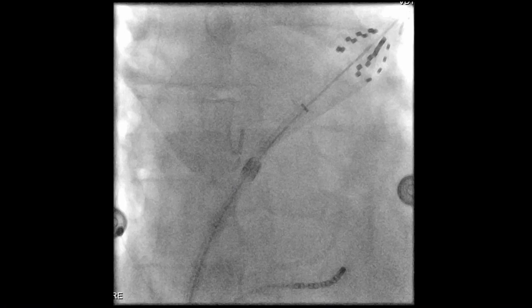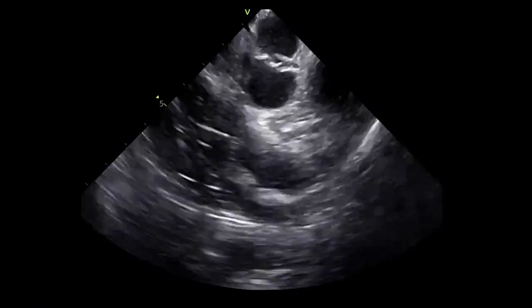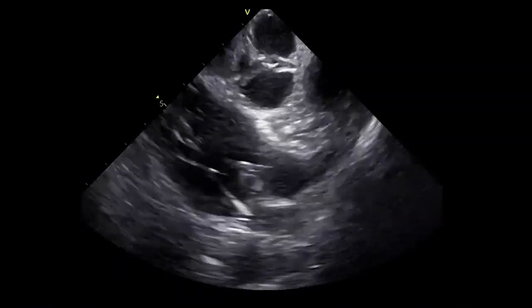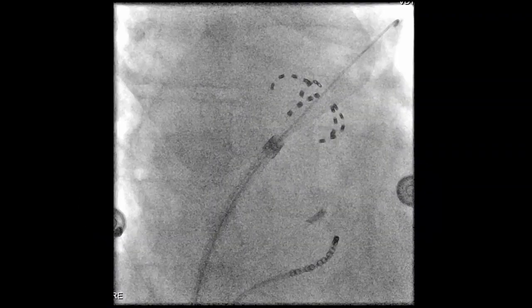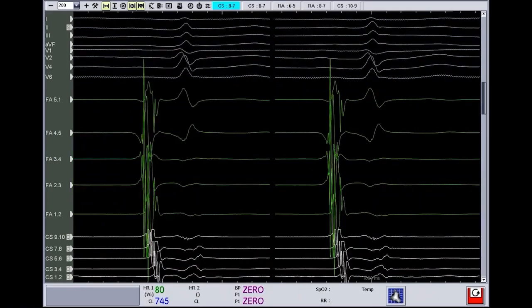This is the corresponding fluoroscopic image. This might be too proximal a position. This is the corresponding fluoroscopic image. And finally, this position seems to be optimal as it nicely covers the ridge. The X-ray image shows that it may be difficult to assess the position of the basket with respect to the PV.